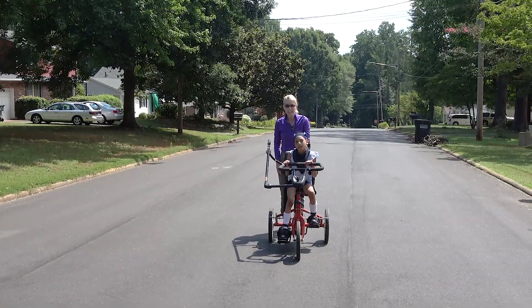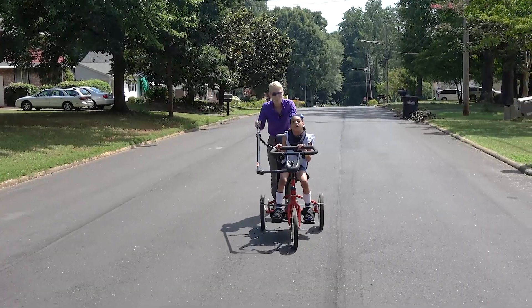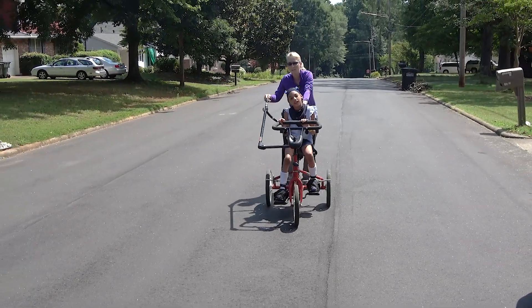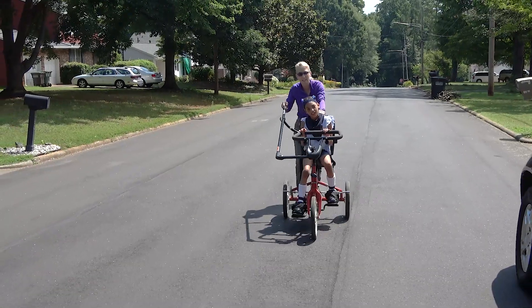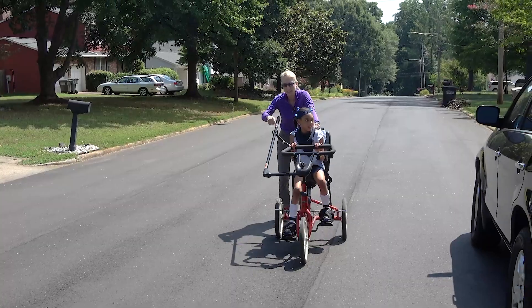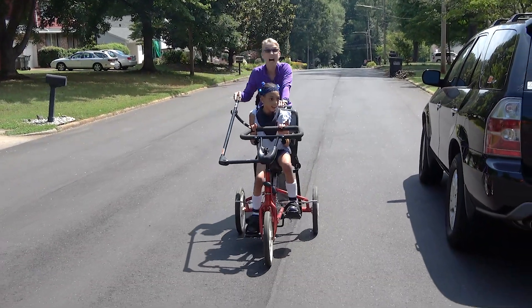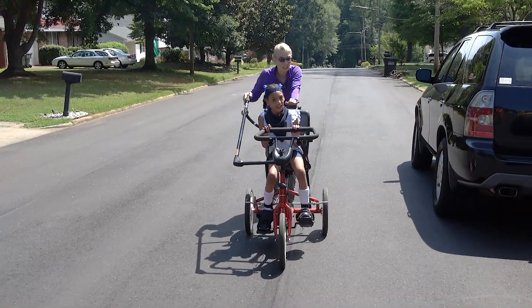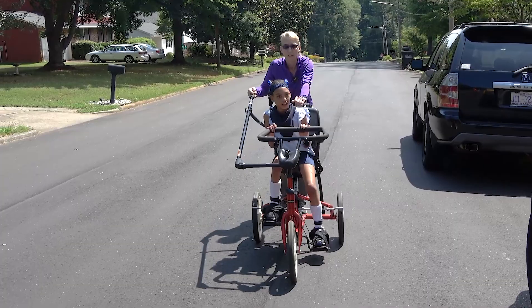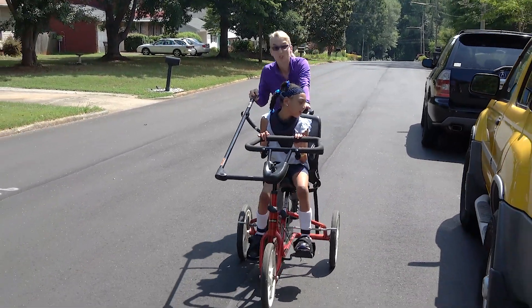Downhill is easier for her. Uphill takes a little bit more work, so I'm going to help a little bit more on this one. I love how with this stick I can steer — I can hold on in the back — so I love this option to have as the rear steering bar. I love it. This is a great tricycle. I also like the Discovery tricycle, but this one's a little bit more cost effective, and I just love it.